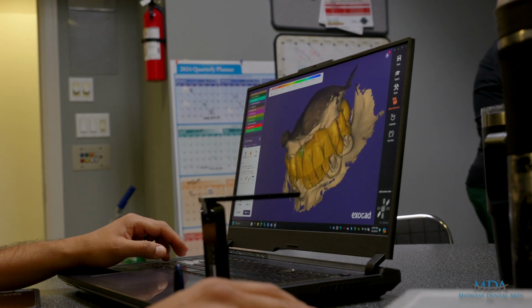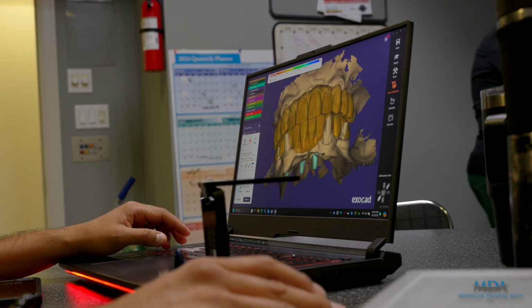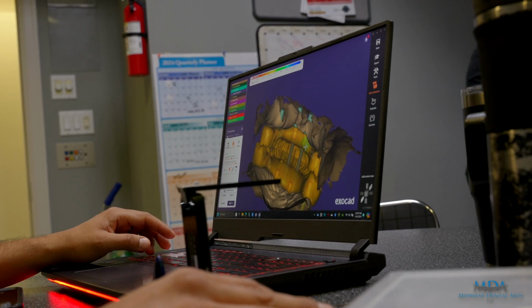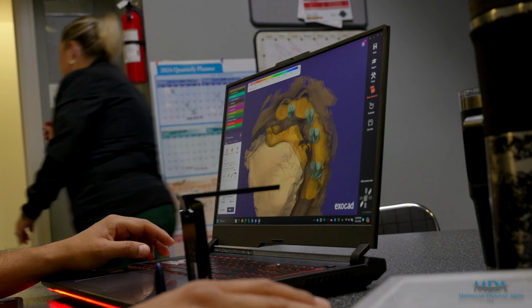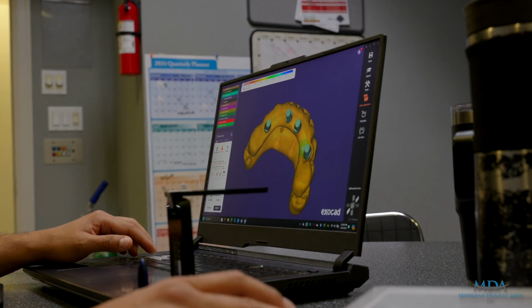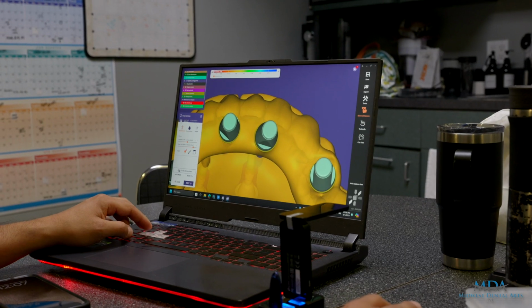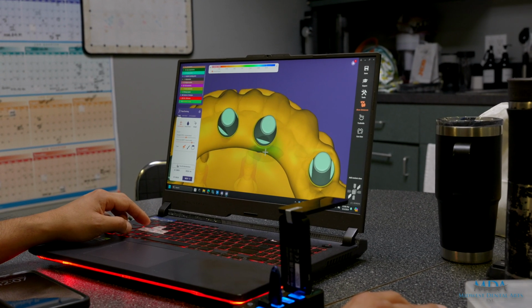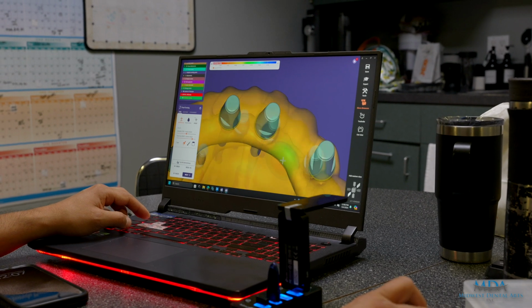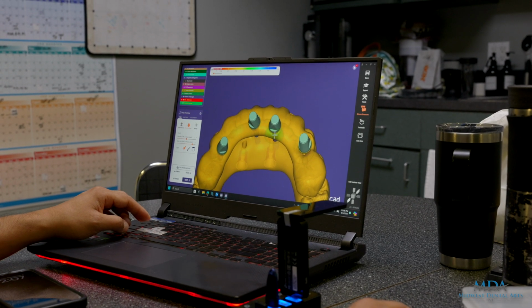So right now we're just taking up a little bit of the excess pressure of the gums and seeing that all of our implants are placed in the correct position with our angle correct multi-units, and also trying to verify a little bit of thickness so it doesn't become too thin of a restoration. If we see that it's too thin somewhere, we can always thicken it out a little bit. Just gonna add a little bit of extra width here, just to give a little bit of strength there, and that's it. I think we're good and ready to go. Get this archway around there. Smooth it out, pretty good.